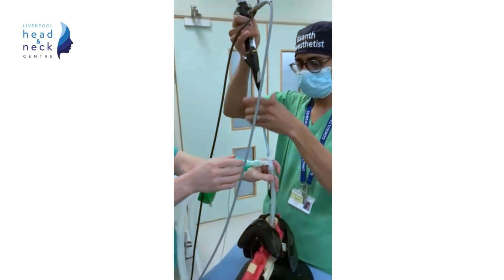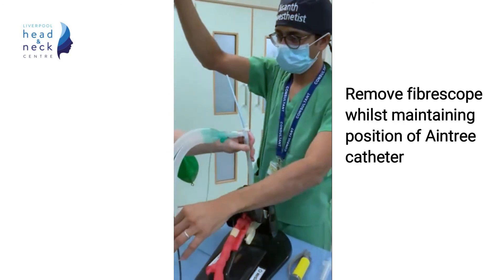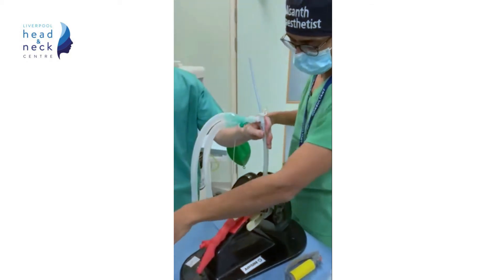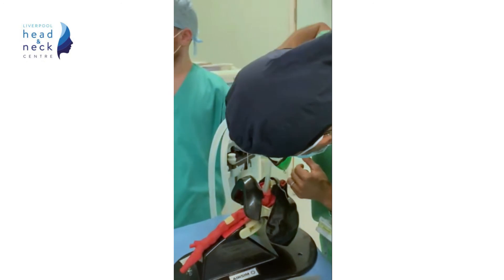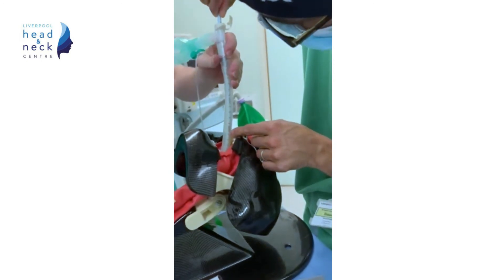The tape is removed and the fibroscope retracted. The Aintree catheter is left in situ and again we check that the depth is okay — here it's 20cm.